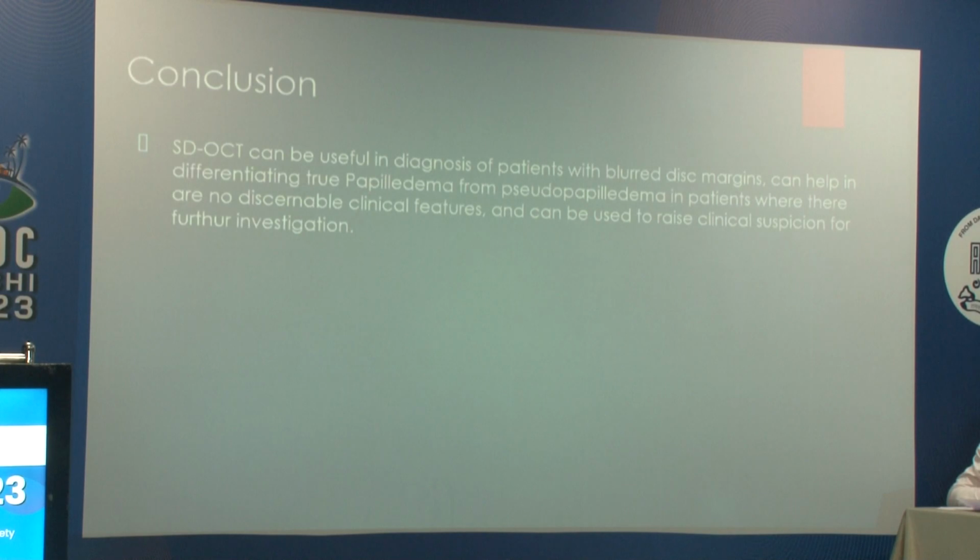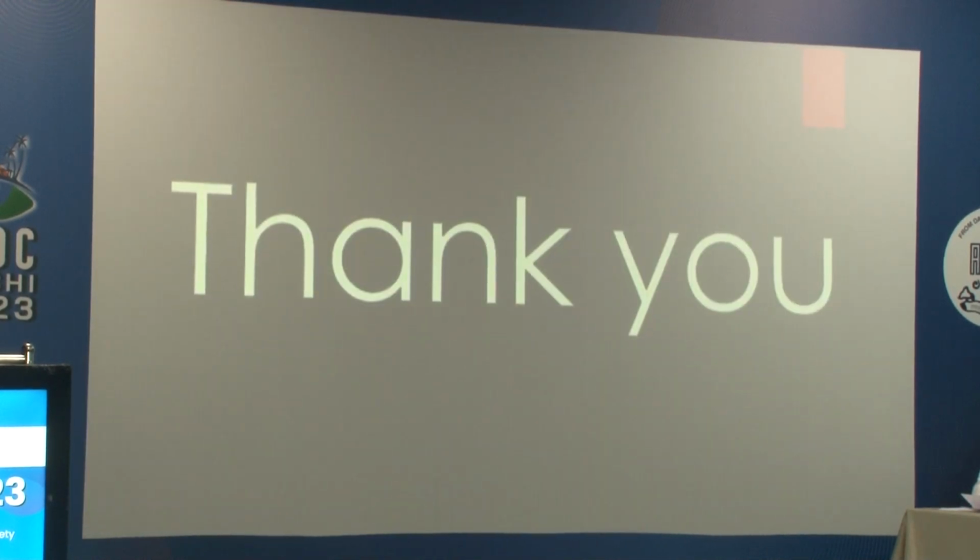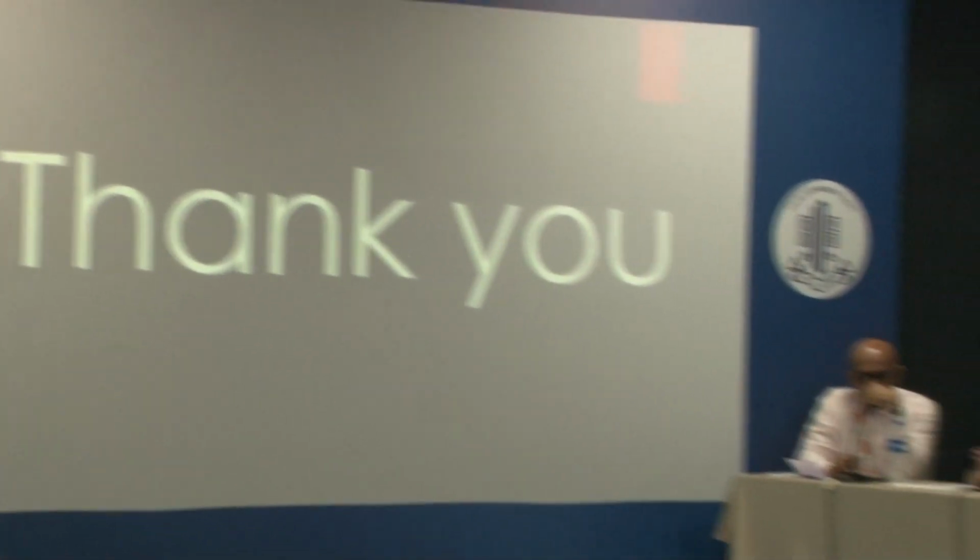The conclusion we came to was that SD-OCT can be useful in the diagnosis of patients with blurred disc margins. It can help in differentiating true papilledema from pseudopapilledema in patients where there are no discernible clinical features, and can be used to raise clinical suspicion for further investigation. The limitation in our study, however, was that the sample size was quite small, so it will be difficult to extrapolate the findings to a larger population. Thank you.